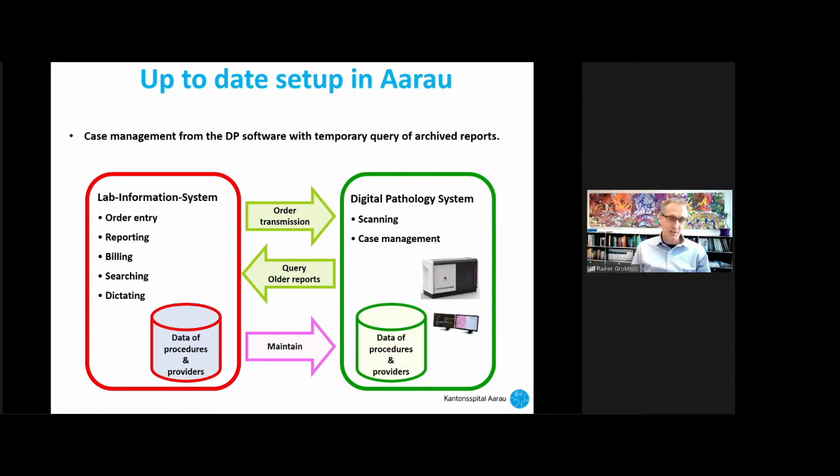And after I close the case, all this data is deleted again and not double stored. Of course, you need to maintain your data procedure and providers so that it is updated. Otherwise, you run into problems, because once the slide is scanned and you don't have all your providers and procedures documented in your digital pathology system, you might run into errors and mismatch of your slides.